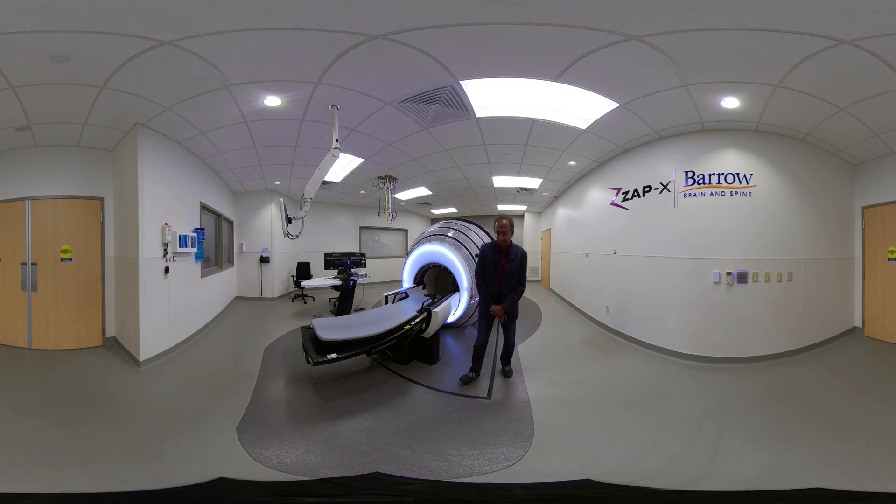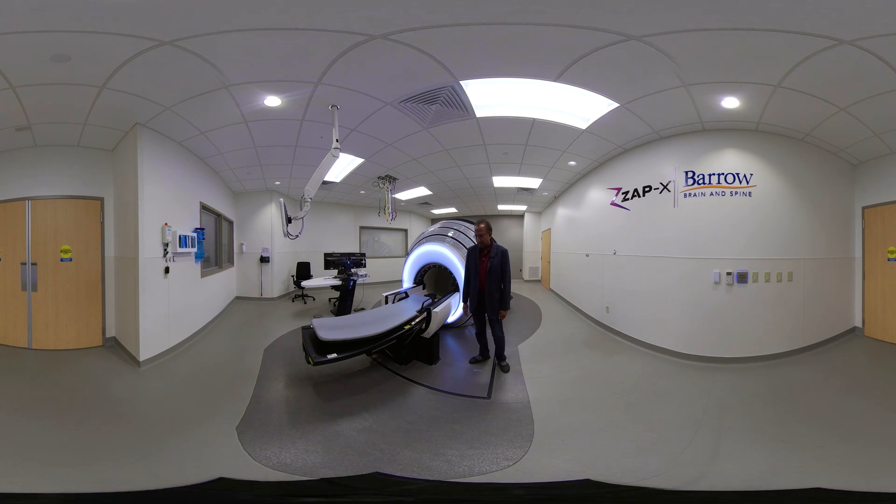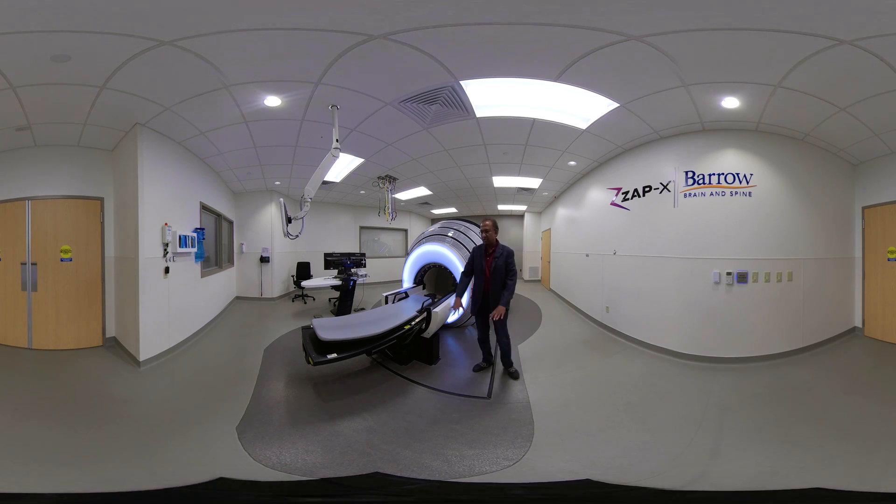We'll start with the floor. You see a dark area and a brighter area here, and there's significance to this. Whenever somebody is standing inside this dark area, all the radiation stops and all the mechanical movement stops. That's accomplished by a laser scanner in the floor here, and there's one other laser scanner on the other end watching this area very carefully. If anybody steps in, everything stops.